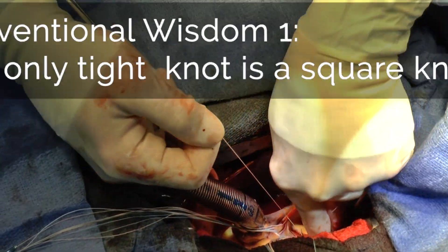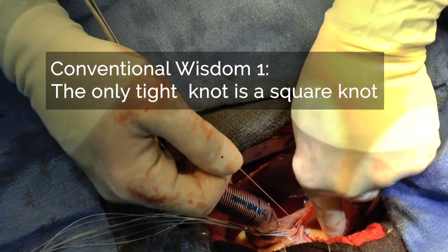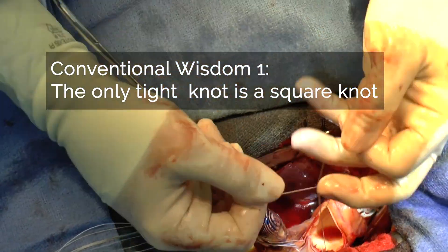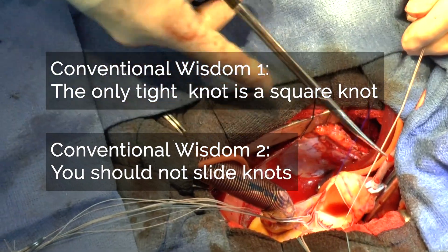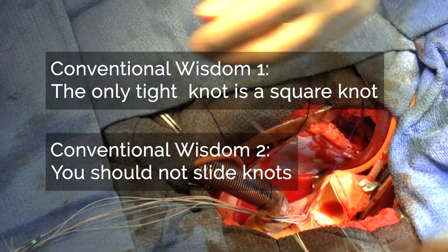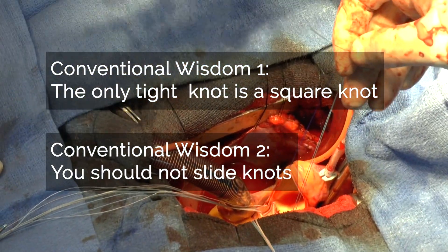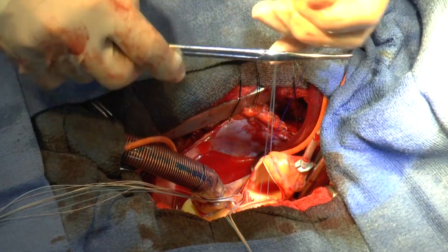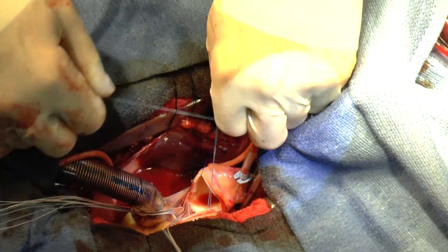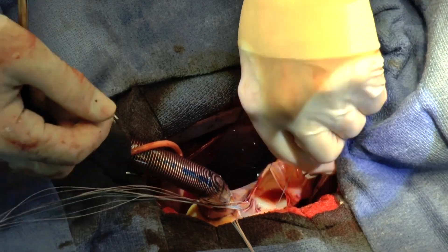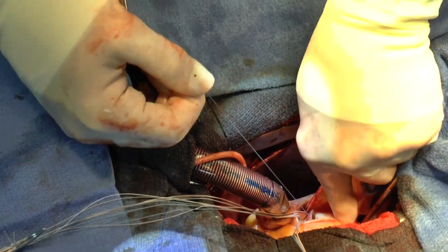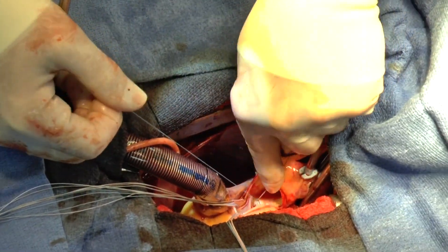Conventional wisdom number one is that the only tight knot is a square knot. Conventional wisdom number two is that you shouldn't slide knots because friction will weaken the suture material and make it likely to break. At extremes of force that is certainly true. However, I'm here with better alternatives to the conventional wisdom and I will show you why.